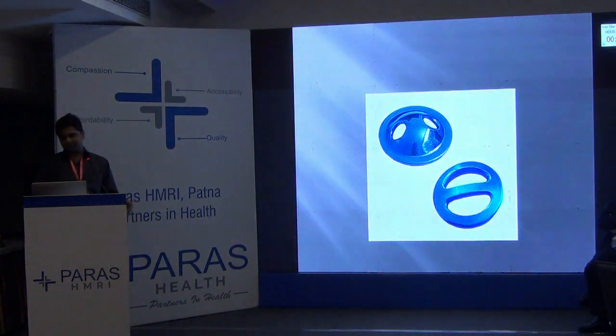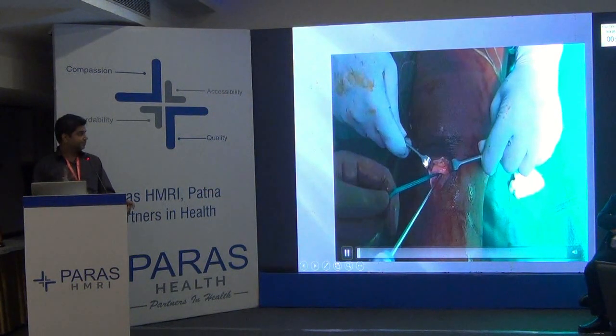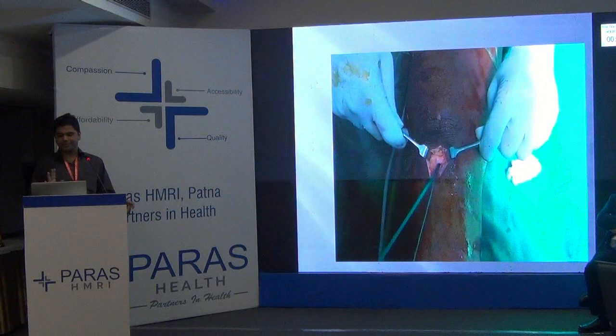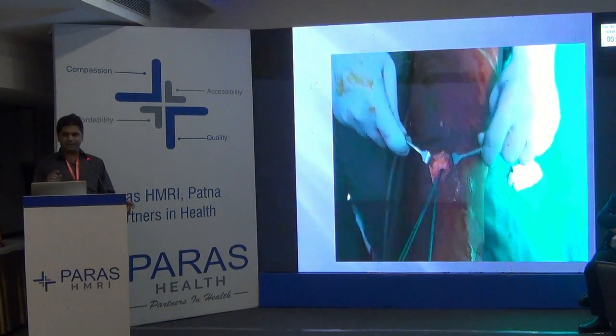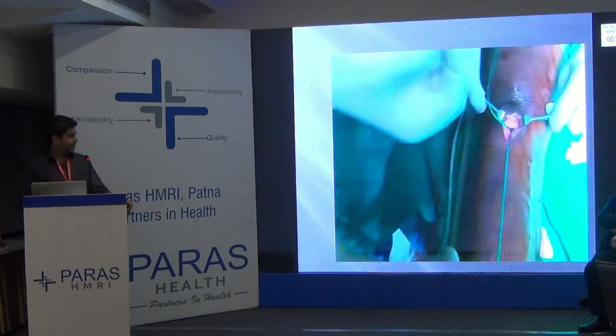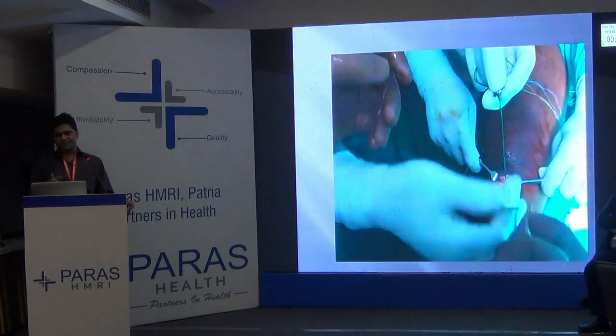This is how the suture disc looks. This is a video about how to tighten the suture disc. See, there is no tendon seen on the mouth of the tunnel. Okay? We always make sure that the one end is tight, so we are sure about the two ends of your ethibond. The graft is stitched with a number 5 ethibond in all the cases.